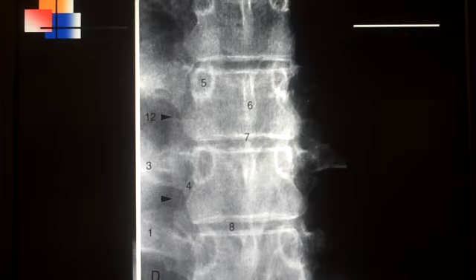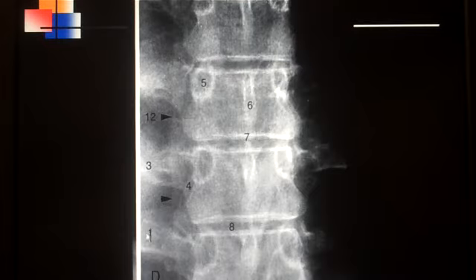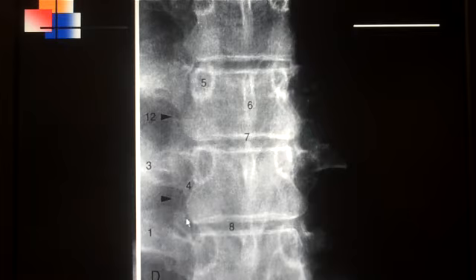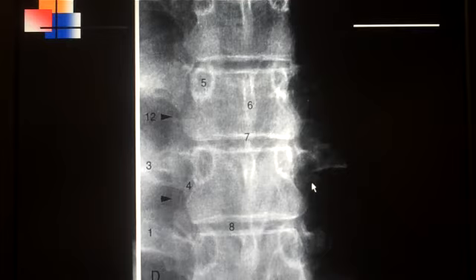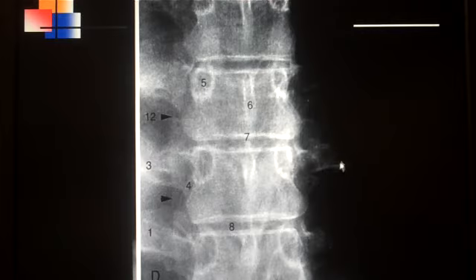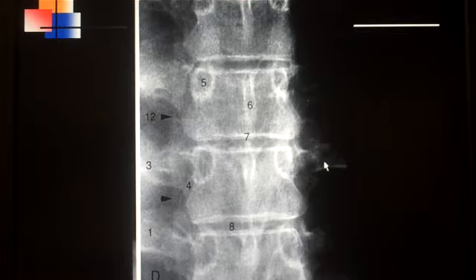Looking at number one, I have the rib that is right here — all of this is the rib. Number two is out on this transverse process right here, so this would be TP. This out here is a rib coming into that transverse process, and where it articulates out of this area right here is your costotransverse joint, which is labeled by number three.